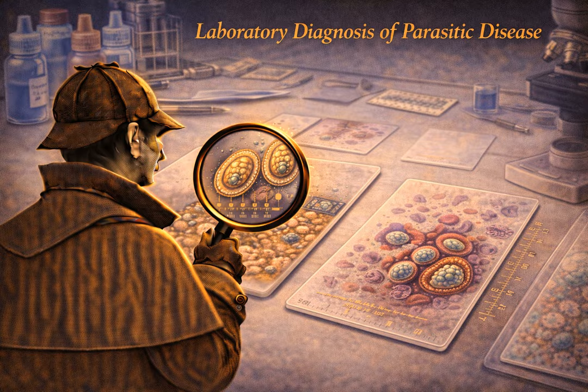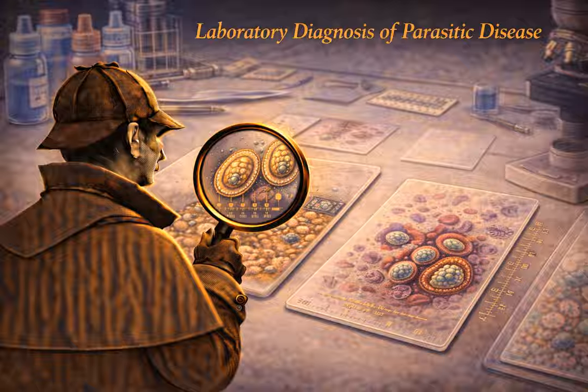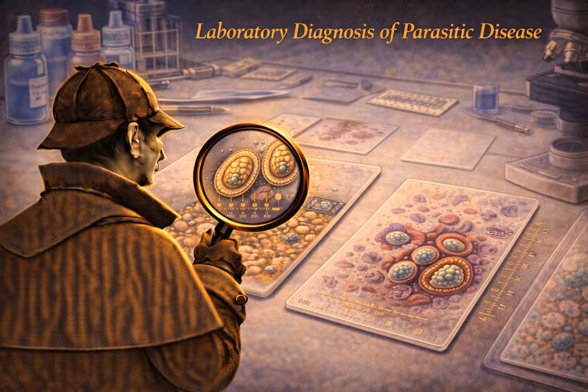Search and rescue, I like that. We need to understand diagnosis by site. Like, is it in the stool, is it in the blood, or is it deep in the tissue? And we have to understand it by method. Are we using a microscope? Are we using antigen detection? Or are we going straight to molecular DNA testing? We are basically going to turn that giant wall of text in Murray about specimen collection into a very logical decision tree for you.